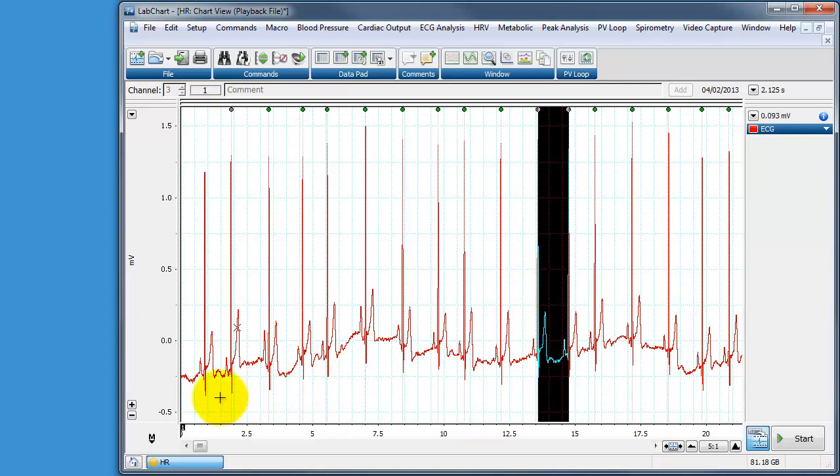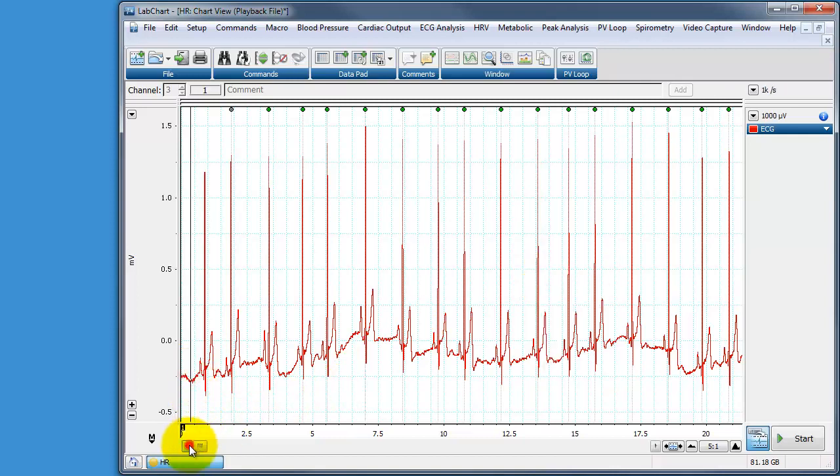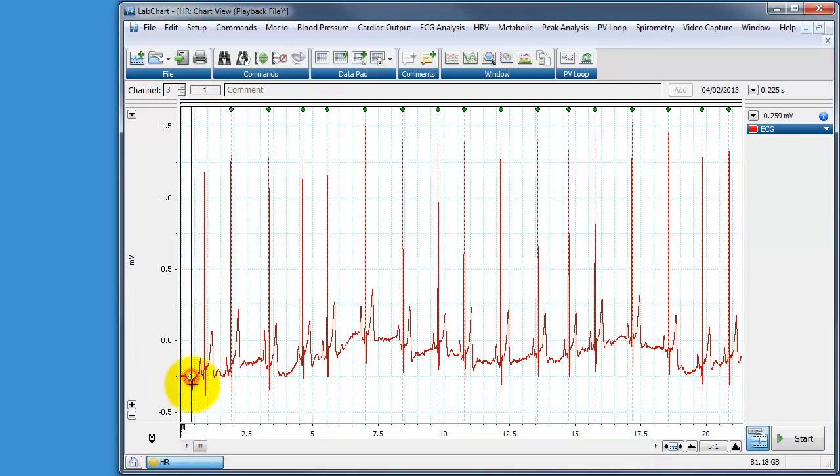So going back to the start of the file again, it just so happens that this file starts halfway between two R waves. So we need to program a macro. So the first search finds the first peak. And then a series of repeats takes place where it finds subsequent peaks and measures the distance between them.